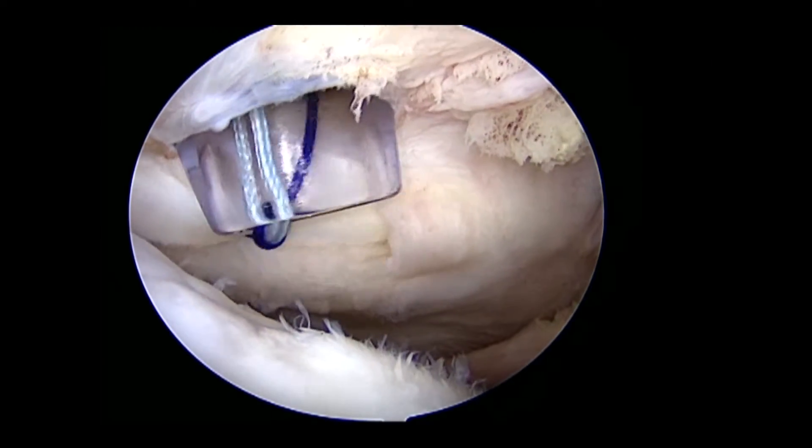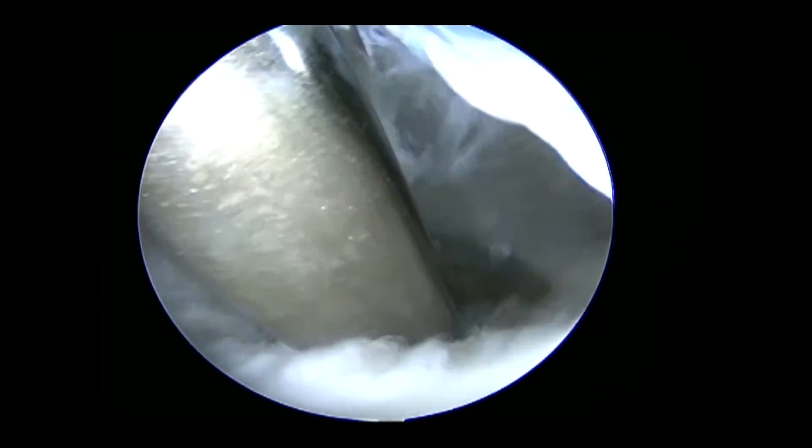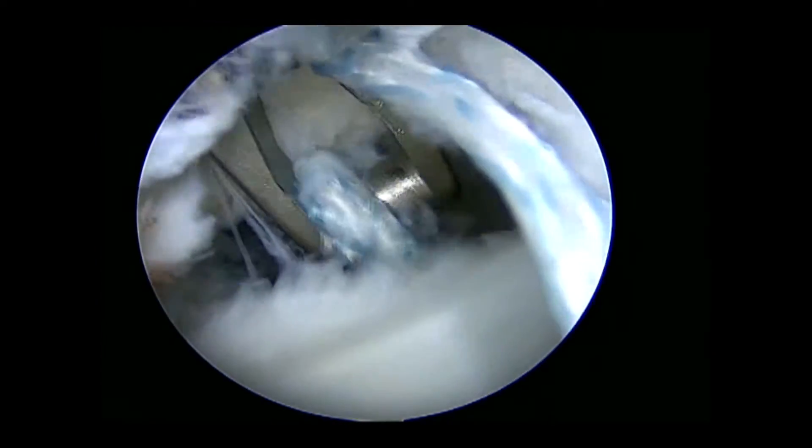The PDS suture is used to shuttle a fiber tape suture, and the limb exiting the anterior surface of the subscapularis is retrieved with a fiber wire grasper through the anterior inferior portal.